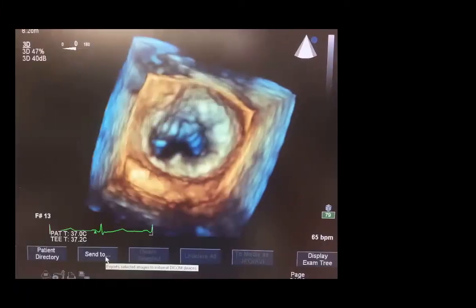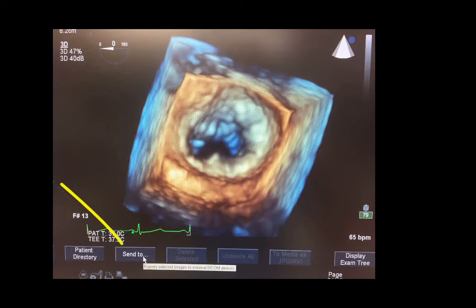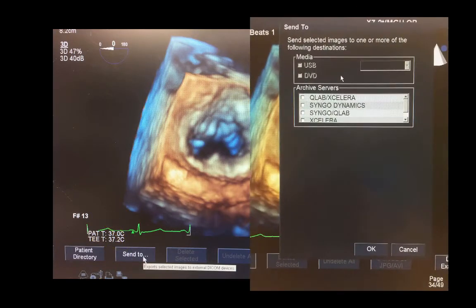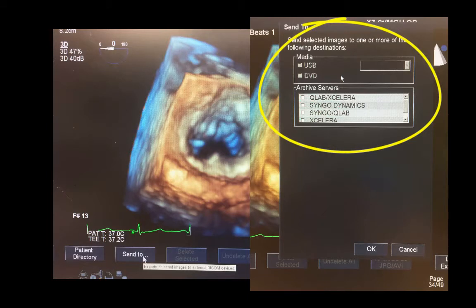After acquiring your 3D image from your patient, select the Send To button on the bottom of the screen. This brings you to a screen that allows you to select the destination. That may be your USB drive, DVD, or to an external server.